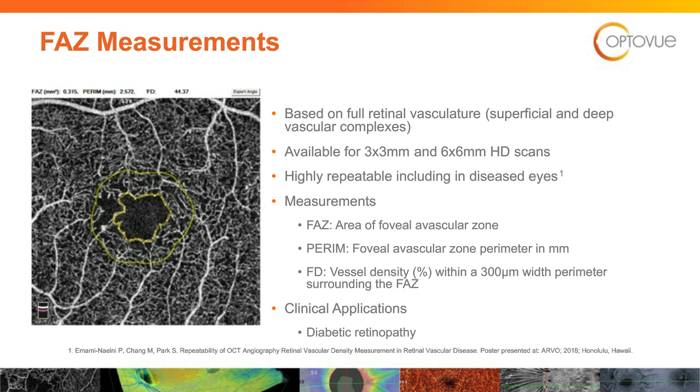Hopefully they stay stable, but if you're seeing a deterioration, we need to recommit to managing blood pressure, blood sugar, maybe a diabetic supplement, follow that patient more closely. Maybe you consider other testing as well, which we'll talk about in just a little bit. So look at those 3 numbers, and I'll show you how to get there in just a second.